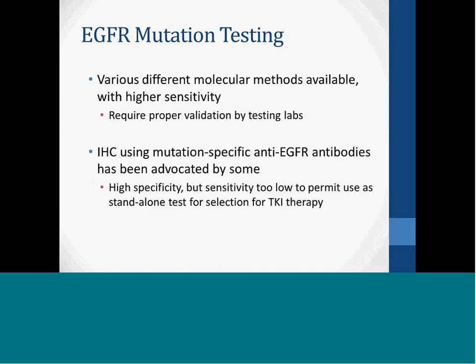As a result, a whole host of different molecular methods have been developed for testing, with significantly higher sensitivity than Sanger DNA sequencing. And the 2013 guidelines for EGFR and ALK testing really don't specify which of these should be used, only that whichever method your lab decides to use, it needs to undergo proper validation.